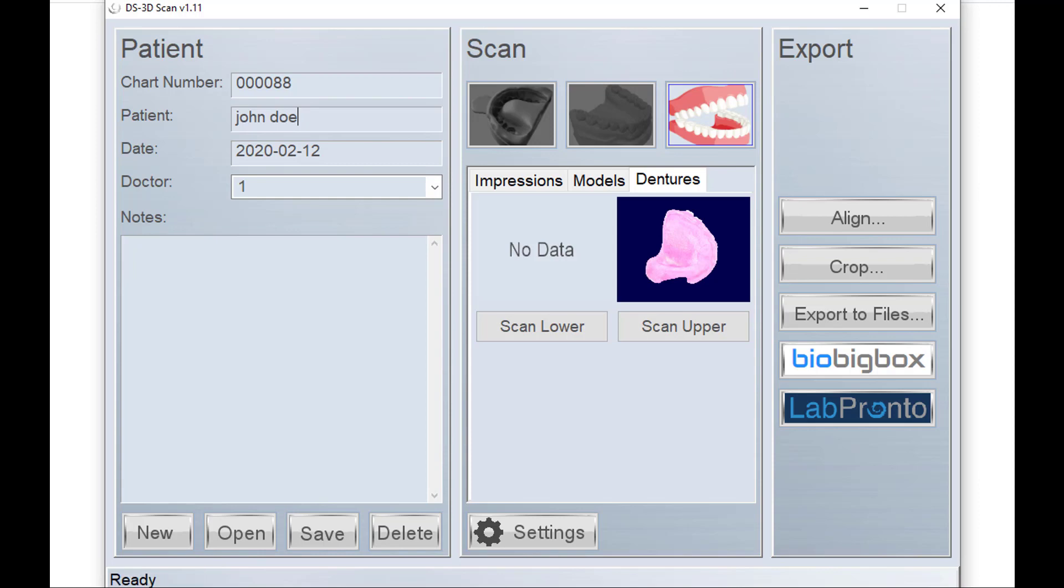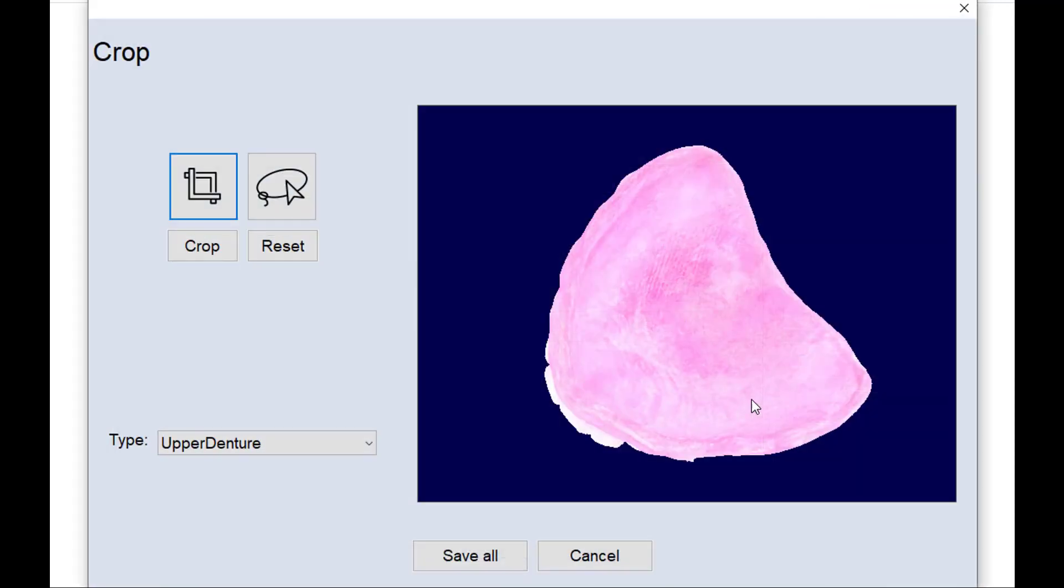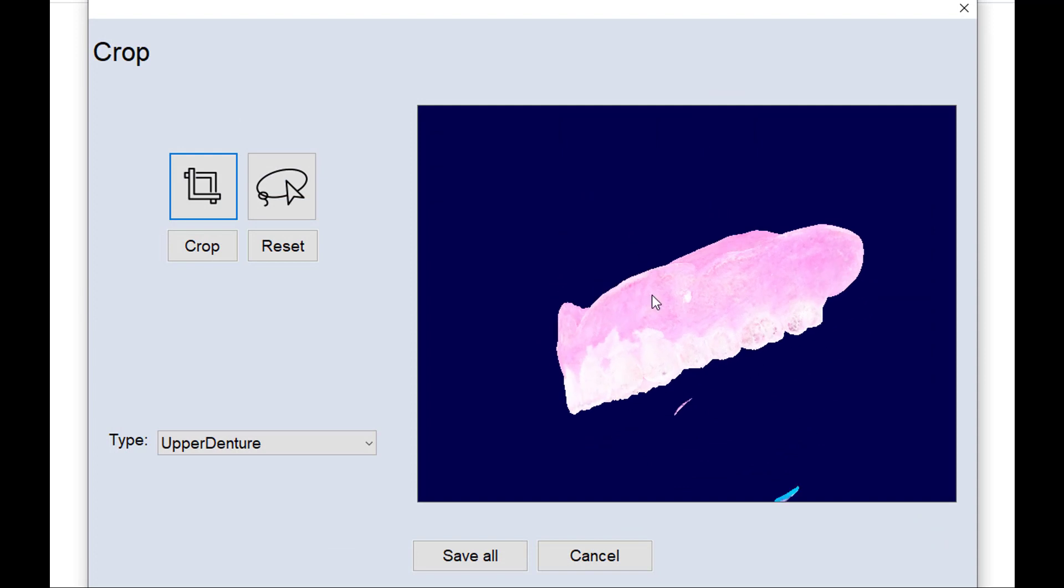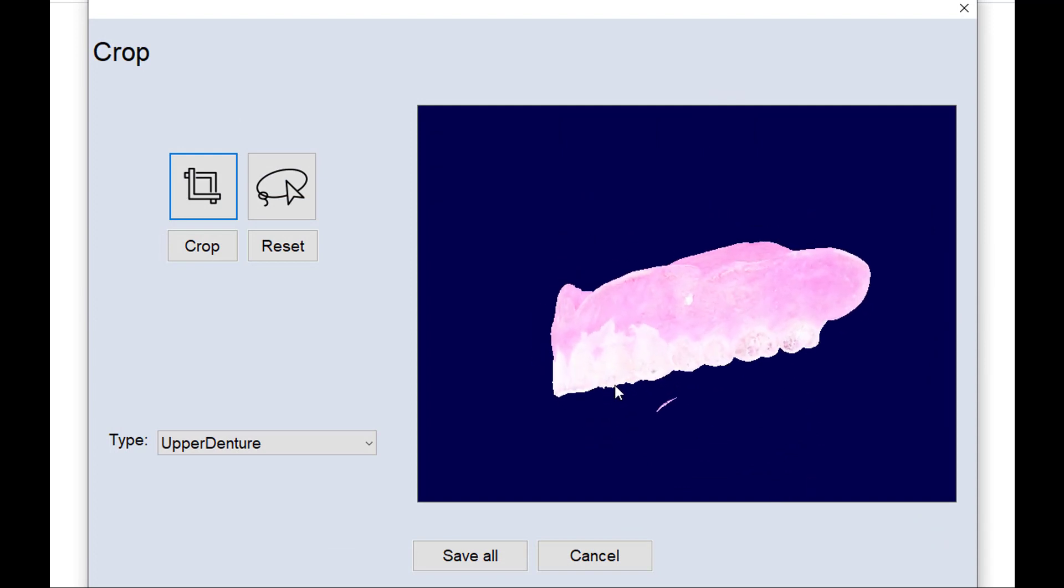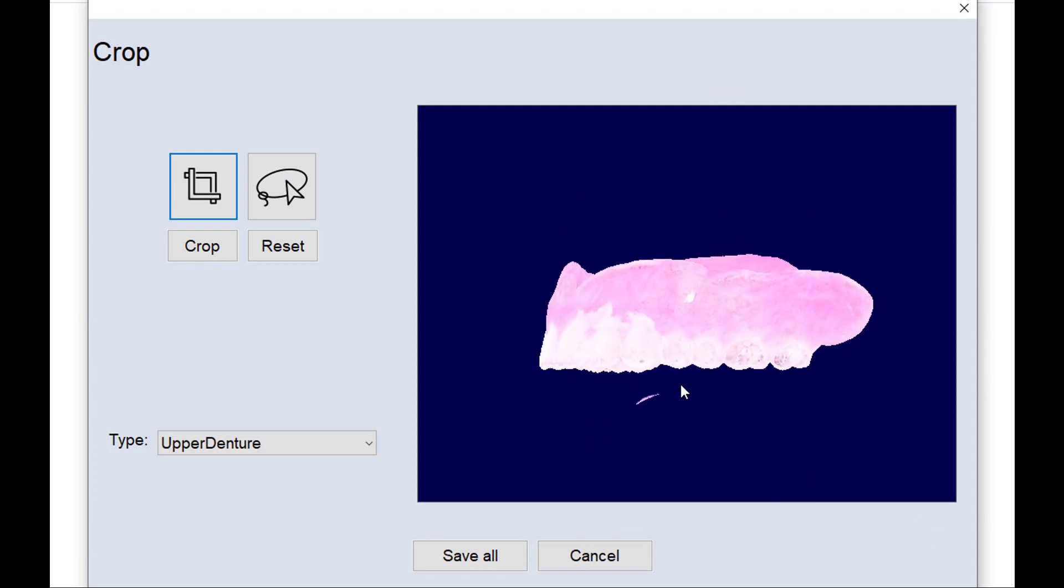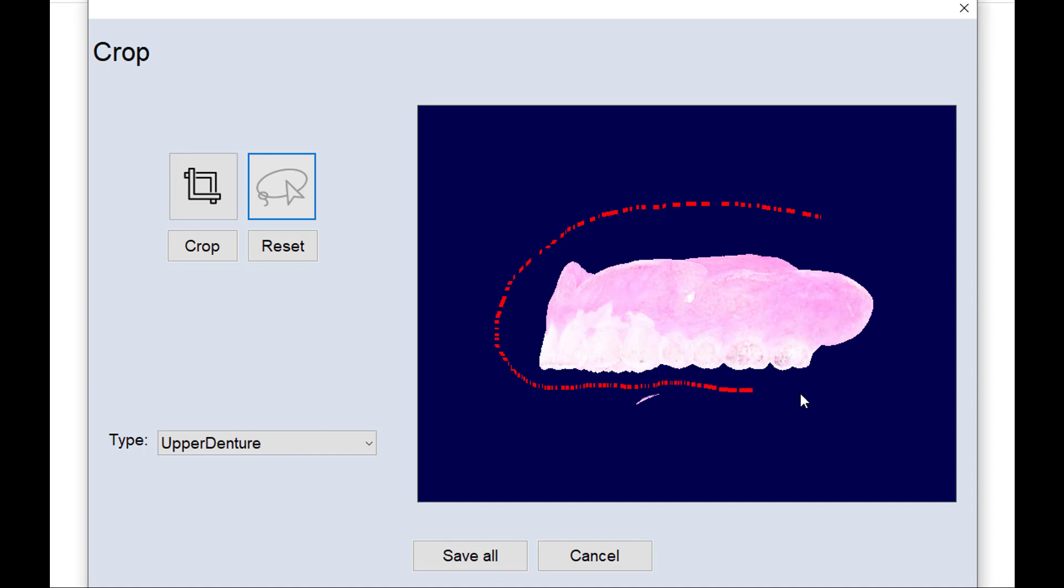OK, with post-processing complete, we're now ready to go to the final step. Now this is optional, but you do have the option to now take that model and crop it. And so with the crop tool, you might have a couple of little floating pieces of model that are out here. I'm simply going to use the lasso tool and I'll hold down shift and encircle the area that I want to keep and then hit crop.